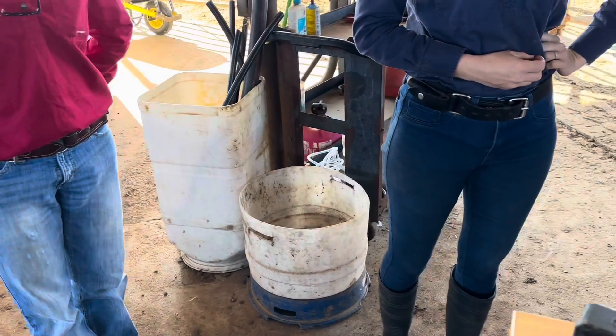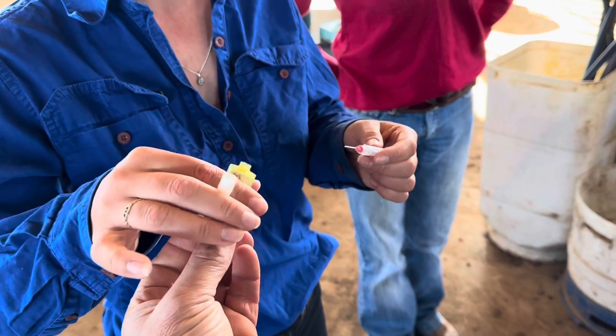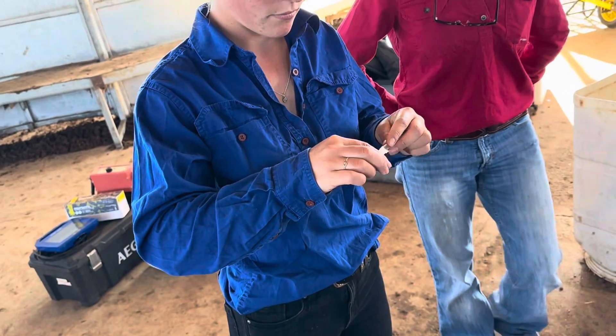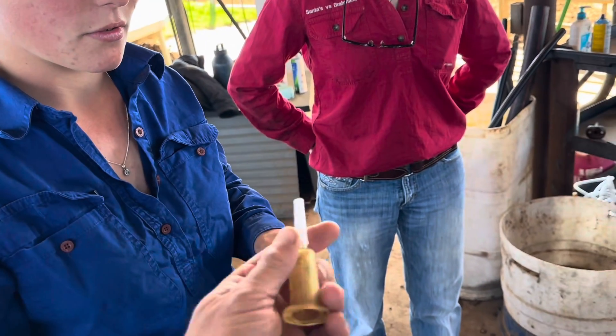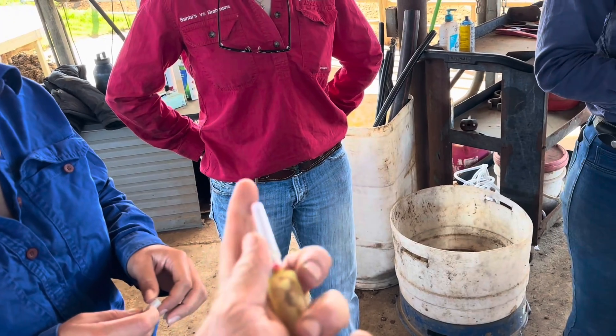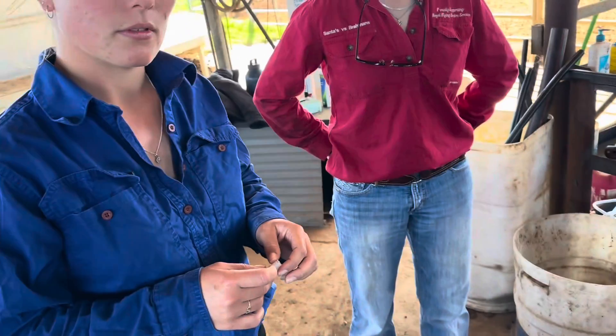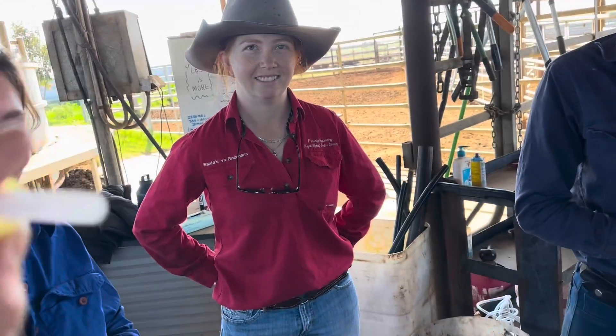See how it's threaded on that end? That just threads into there. Righty tighty, lefty loosey. Nice and snug. Beautiful. Now that's loaded — see? So when that comes off, see there's a needle in there. So this end pokes into the bottle. Sometimes they make these with a little condom on them for safe bleeding.